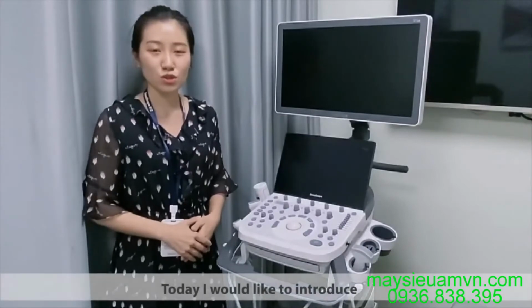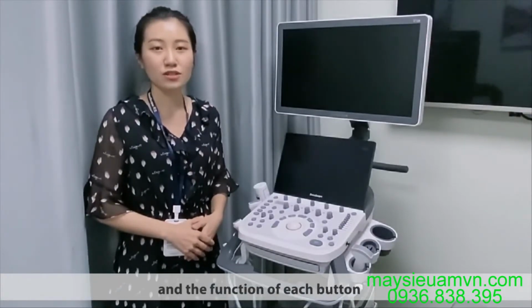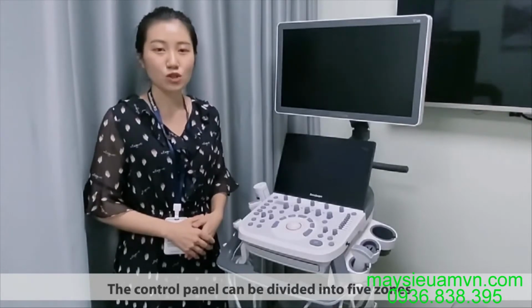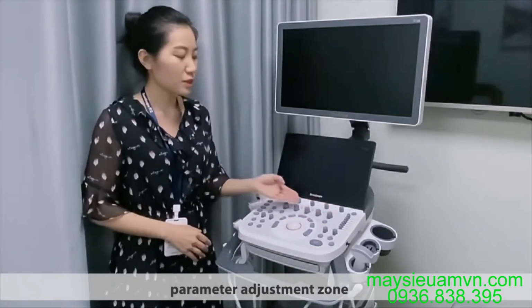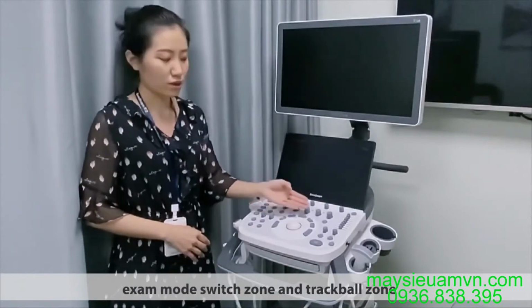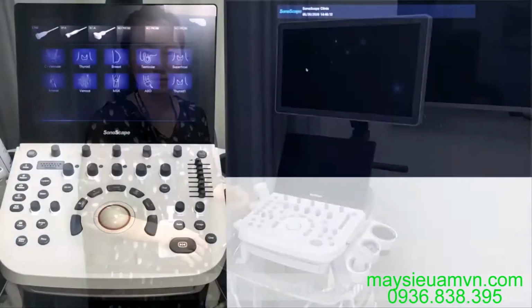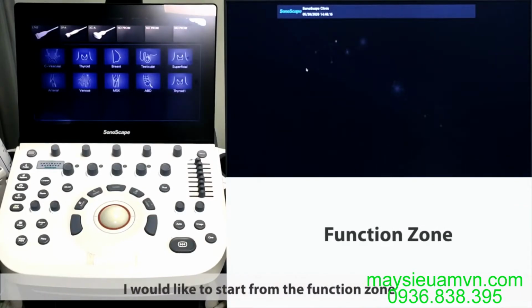Today I would like to introduce the layout of P20 control panel and the function of each button. The control panel has been divided into 5 zones: TGC zone, parameter adjustment zone, function zone, exam mode switch zone, and tracking ball zone. Now we can move on to the detailed functions of each button. I would like to start from the function zone, which has the most buttons.